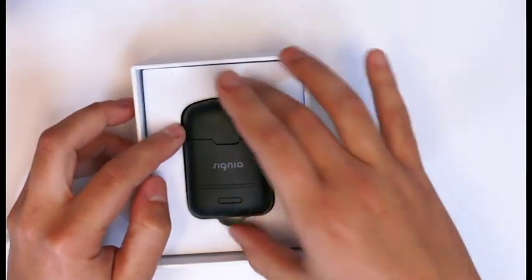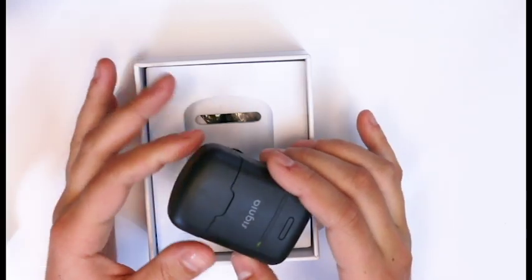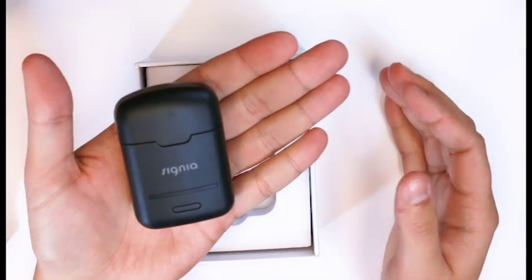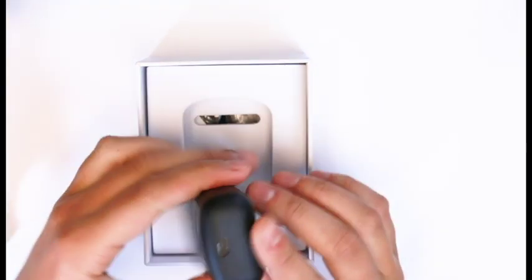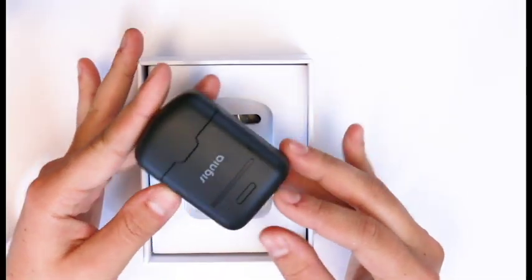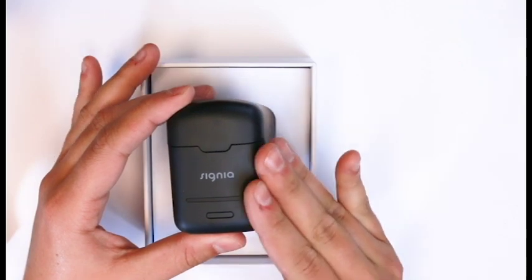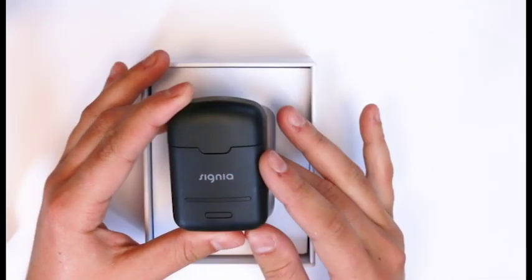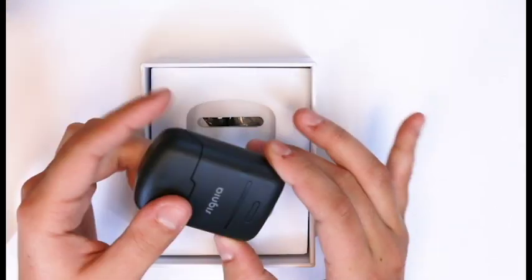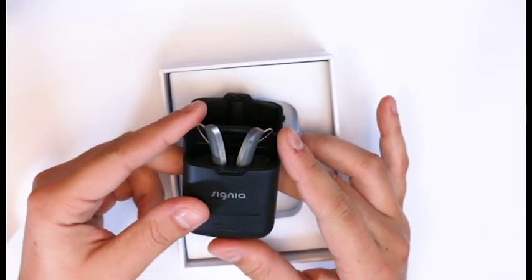It comes in this nice charging case — we've got some LED lights on the front as charging indicators. This charger is wireless, and it plugs in at the bottom. This charger itself can hold up to three full charges on a single charge of the case, so if you want to go for a weekend without bringing cords, you can just slip this in your pocket and you're good to go.